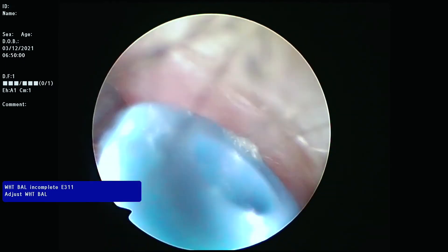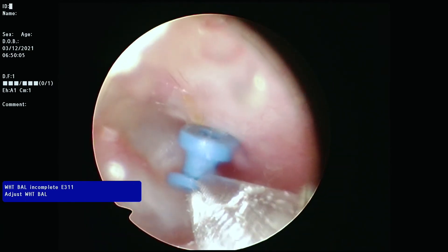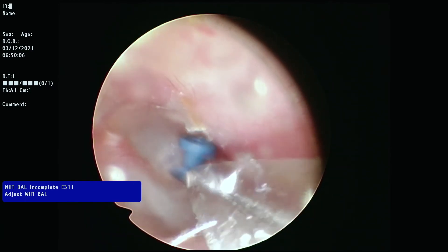Finally, a fluoroplastic tympanostomy tube is placed in the myringotomy incision. This allows for continued long-term ventilation of the ear.